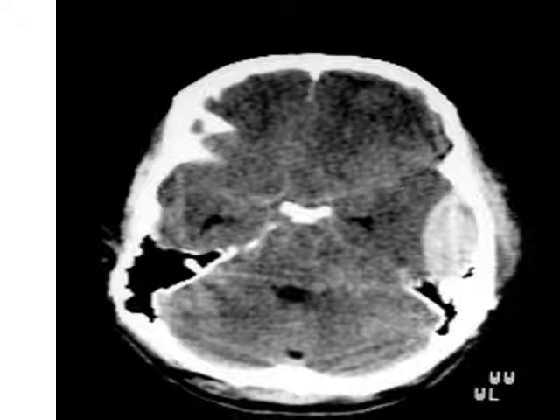What about this image? It is a CT brain. Look here. It is a hyperdense lesion. Is it epidural or subdural? It is epidural hematoma.